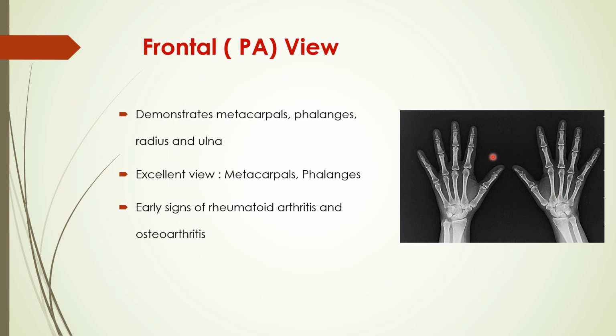The frontal view will provide us very good visualization of the metacarpals, phalanges, radius and ulna, and it is an excellent view to look at metacarpal or phalangeal fractures and also early signs of rheumatoid arthritis or osteoarthritis.